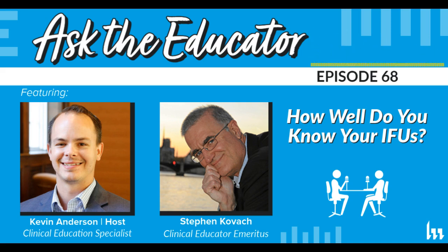What do you do? No, I think you're onto something right there with trying to treat them all the same, but using the more rigorous process in order to achieve the optimal result. Yeah, you could be following the IFU because it's from 1955 and hasn't really been updated for a particular suction, but it's still better to maintain a consistent process with all your devices as much as you can possibly do, without having conflicting information in IFUs.